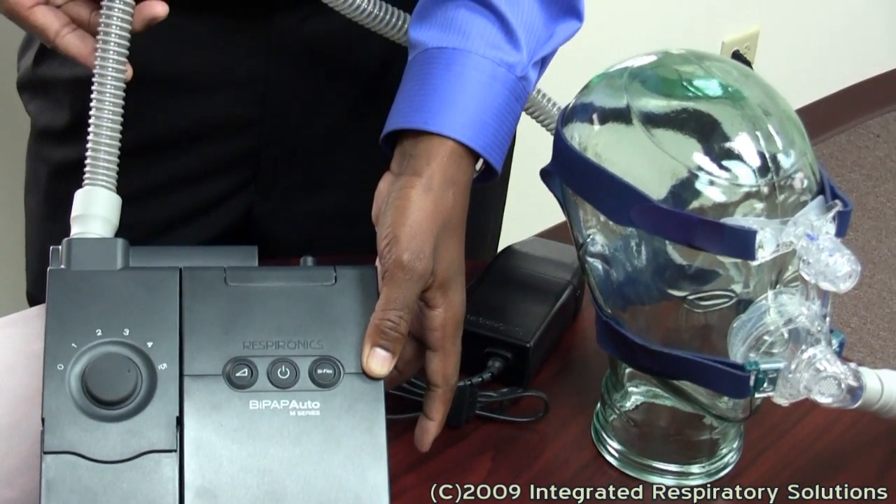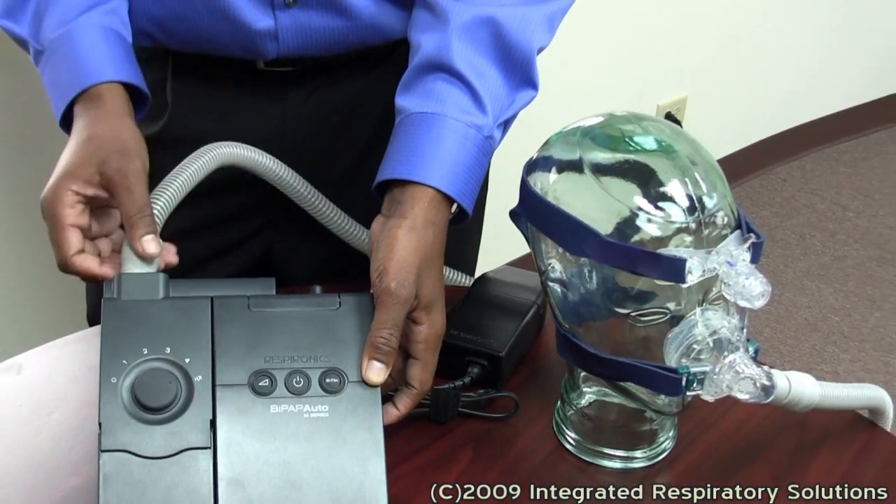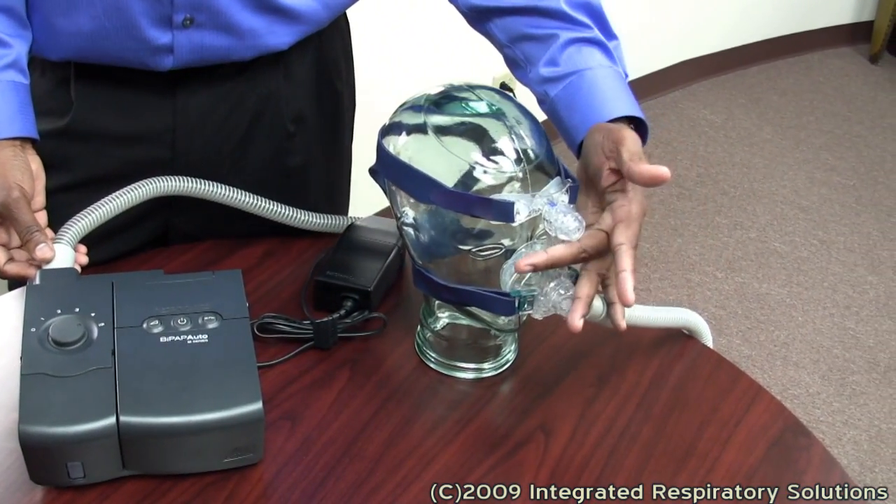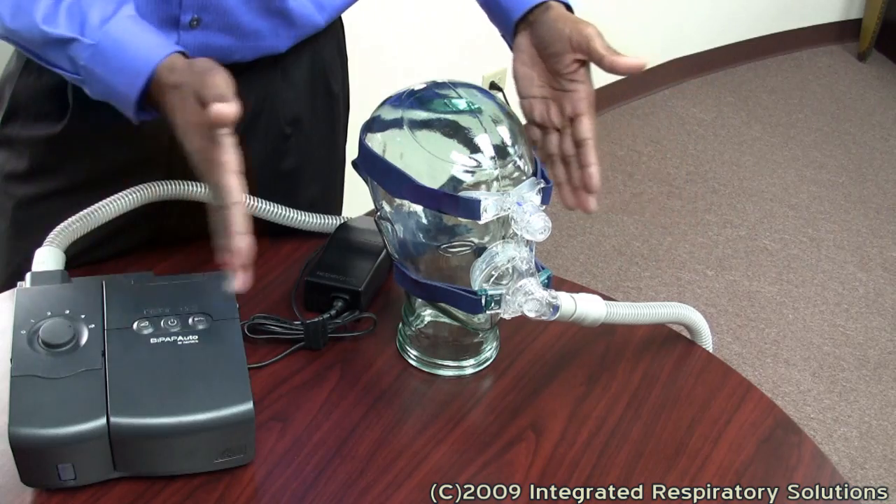The BiPAP tubing is connected to the humidifier, which leads to your mask, which is connected to your patient.